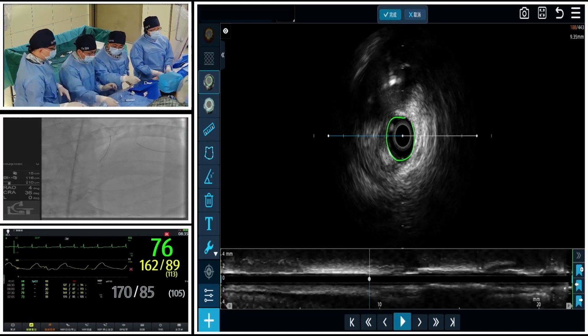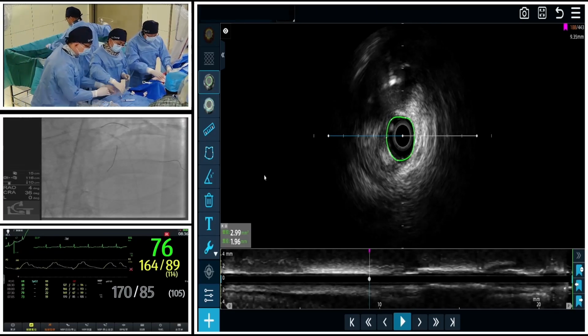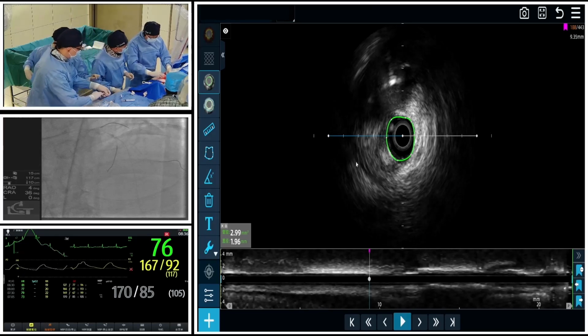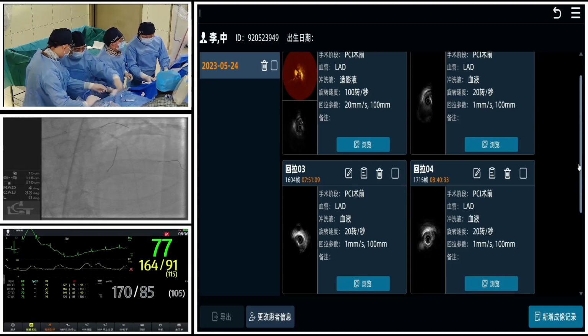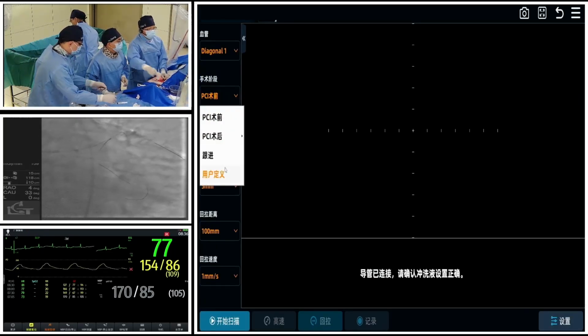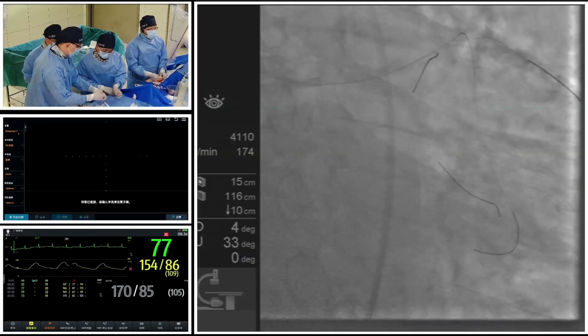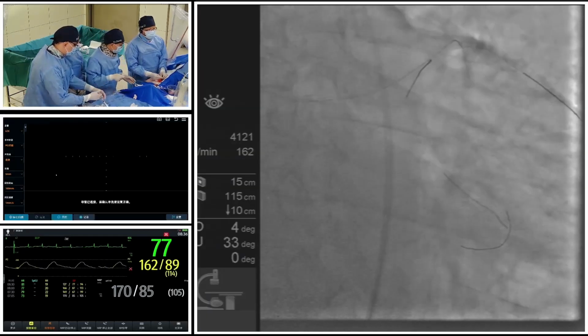Okay, check again for the circ. Check the ostium of the circ, please. Okay, let's check this circ.